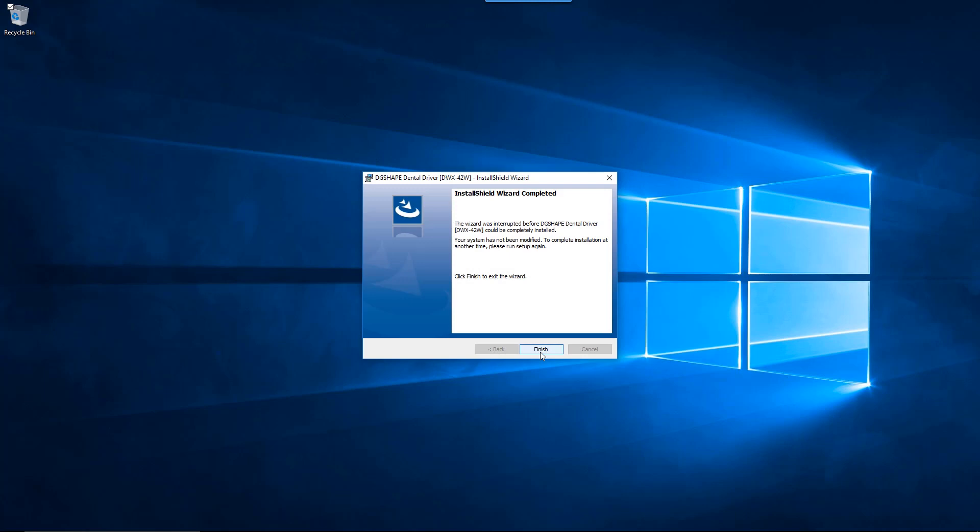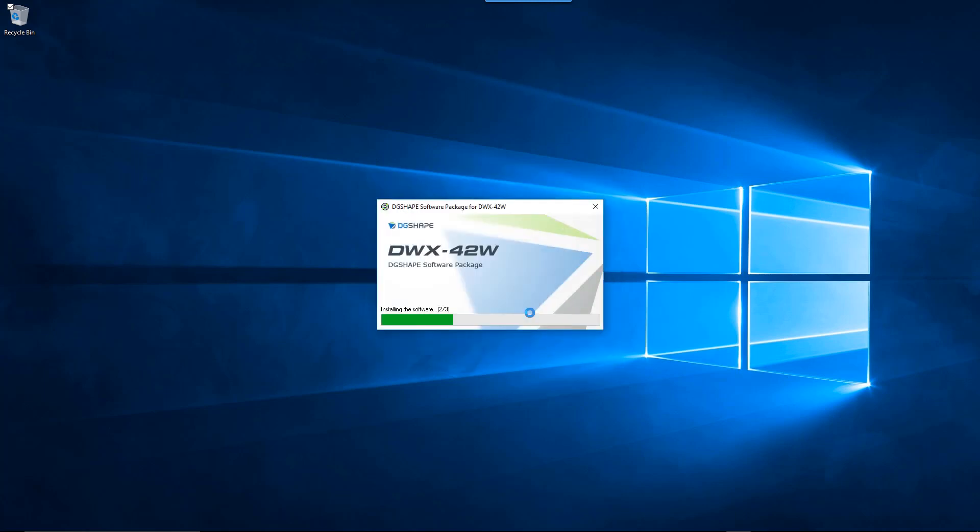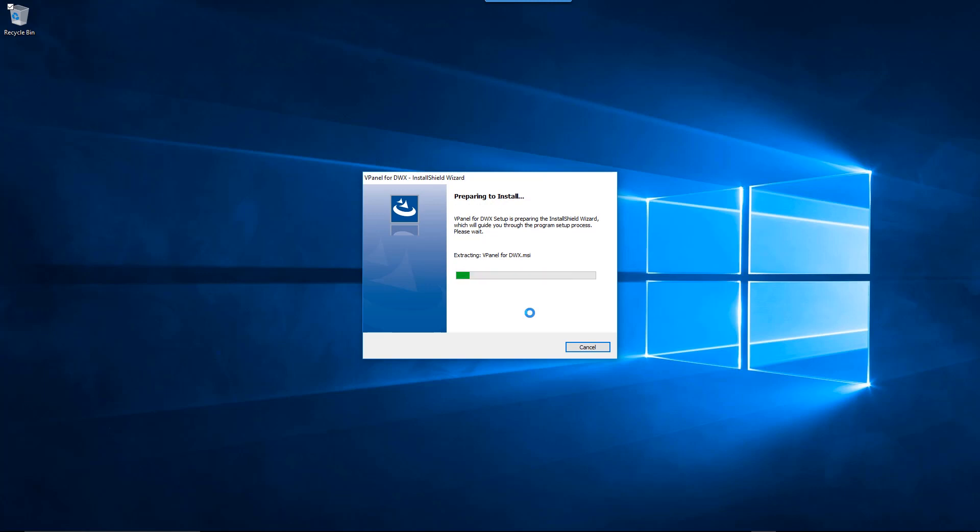Once the driver has completed installation, click the Finish button to begin installing vPanel software on your computer.